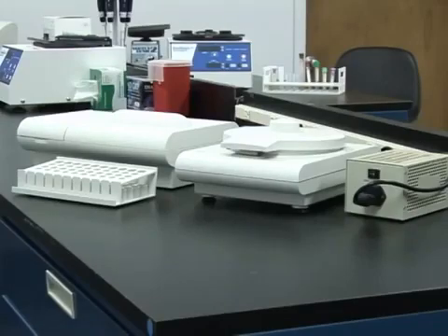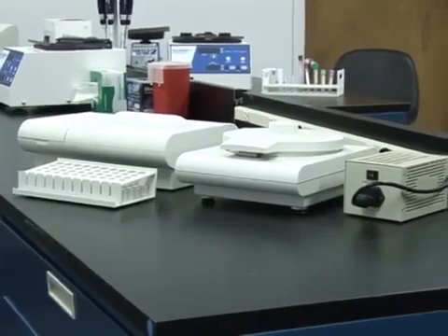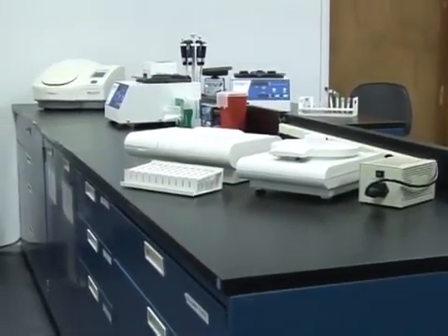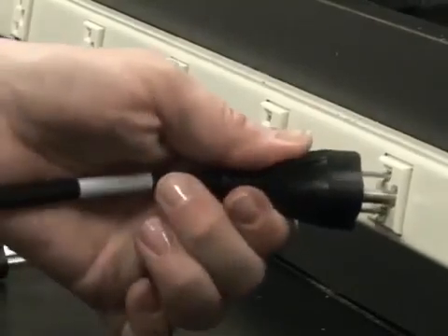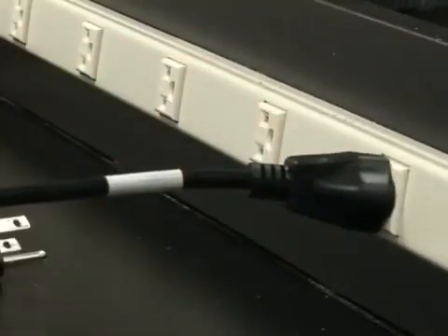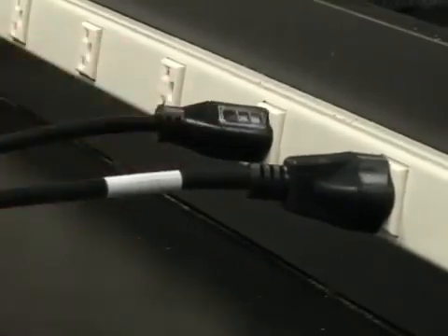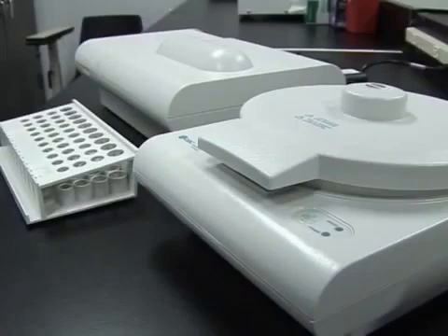It is also important to place the machine in a location with sufficient room to work. Make sure there are enough outlets. If possible, have a dedicated outlet for all three components: the Autoread Plus, centrifuge, and printer. The printer will arrive in a separate package.